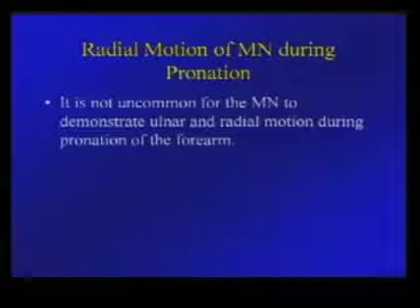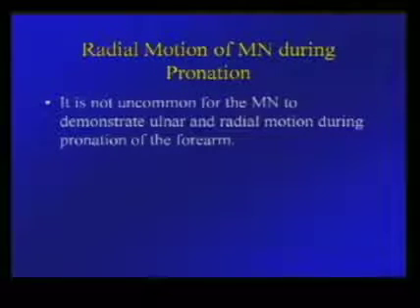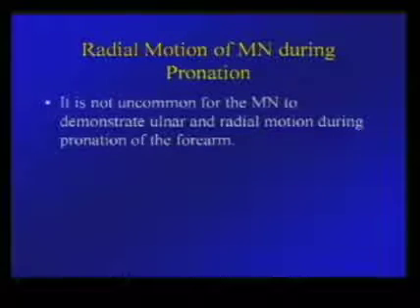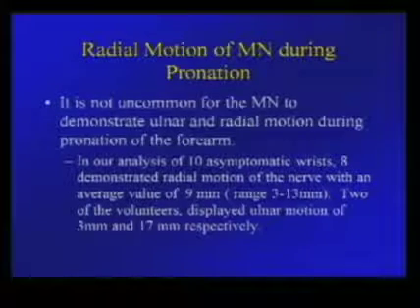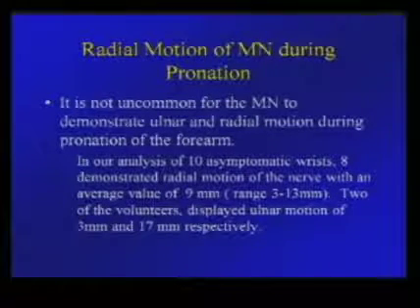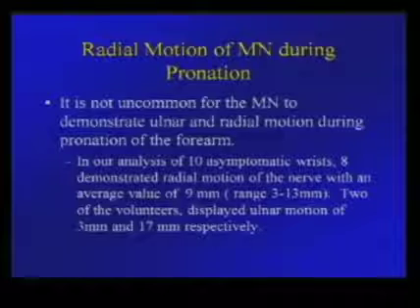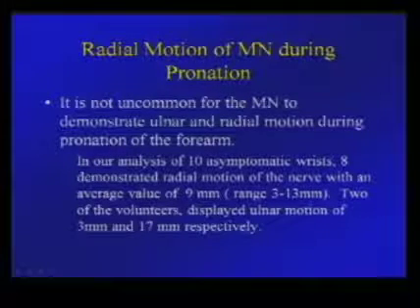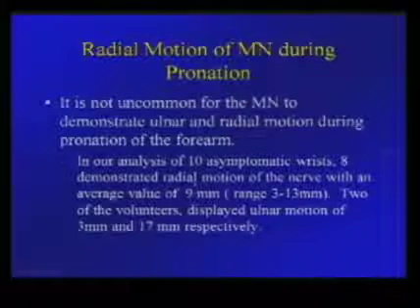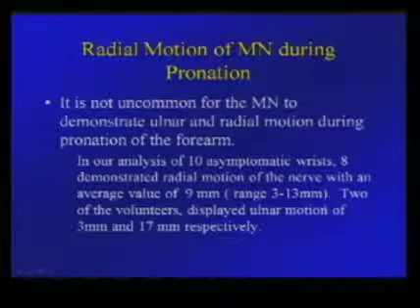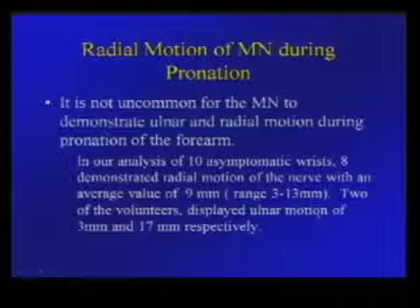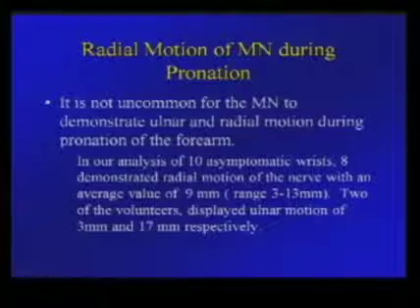There is movement of the median nerve during pronation of the hand. It is not uncommon for the median nerve to demonstrate either ulnar or radial mobility during pronation of the forearm. We have studied this in asymptomatic wrists, showing that there does not seem to be a predilection towards which side the nerve moves — sometimes it moves to the radial side, sometimes to the ulnar side, but movement observable by ultrasound is present.